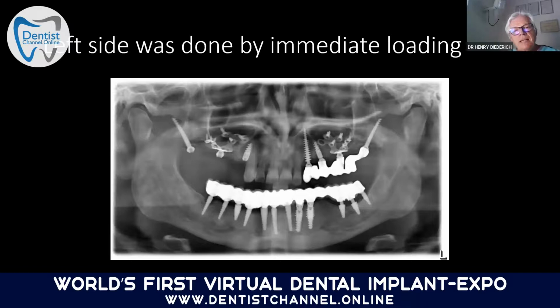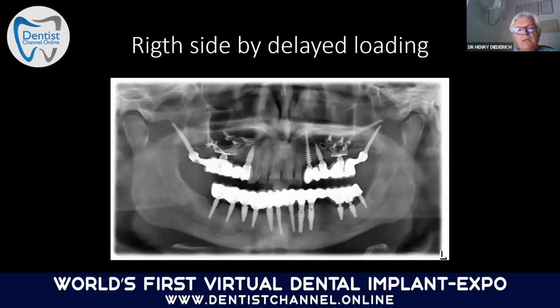But on the right side, we had to go by delayed loading because the bone situation on position 14-15 was not so much. And then I prefer to go by delayed loading. And here you see now the right side was done by delayed loading. But anyway, the patient was done by a minimal invasive procedure without any complications.